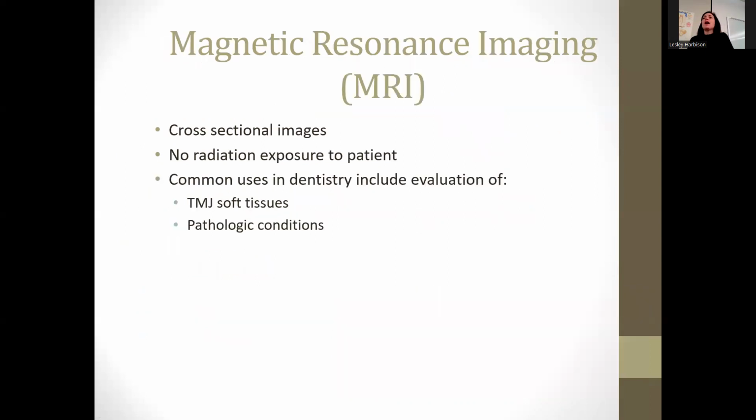And then another one could be an MRI. Somebody could go in for an MRI. No radiation for that, that's magnetic. People get MRIs for lots of different reasons. So that could be something that someone would have, maybe for temporomandibular joint dysfunction or something like that, or to find out if there's some pathology somewhere. So those are just other kinds of images that can happen in the head and neck region.